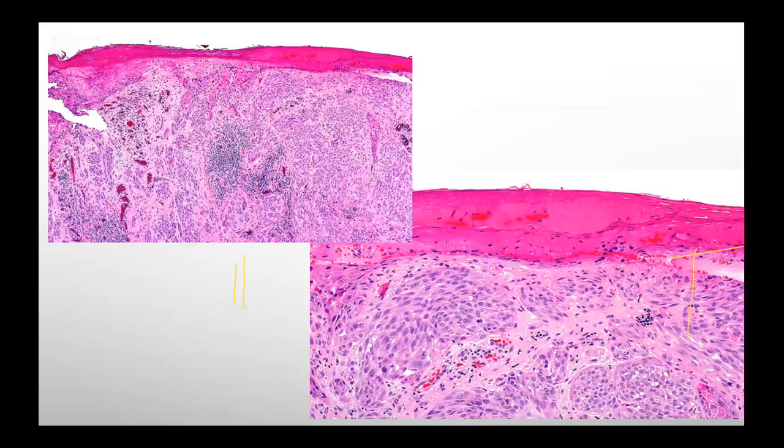So you'll see the large cell with the abundant cytoplasm, with the spindle or polygonal cell. The nuclei are more homogeneous, and there is an important feature, the maturation, because as you go from the top to the bottom, the cell is more mature and larger on the surface, and it's smaller on the base as well. Okay, and that's a usual hint.